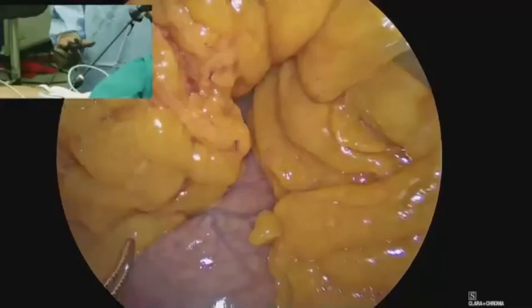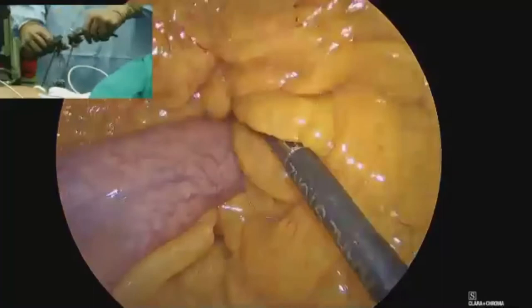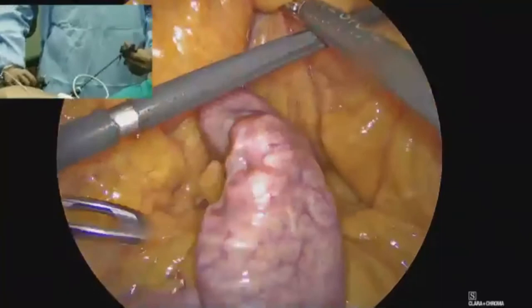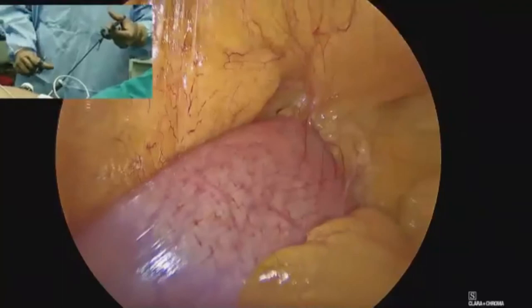We would want the anesthetist to make the patient supine and a little straight so that we can trace the anatomy, so that anatomy can be demonstrated to all of you. Now, this is the ligament of Treitz. I don't see the inferior mesenteric vein because of a lot of fat, but nevertheless, let's start to count.